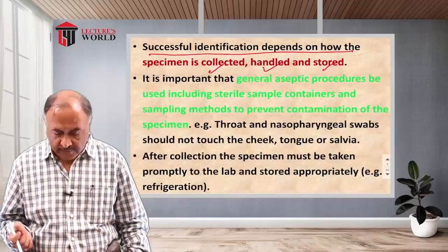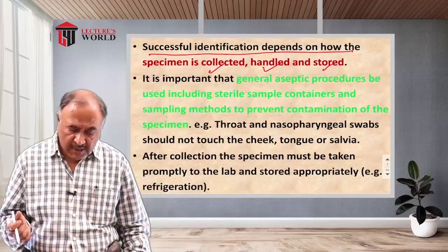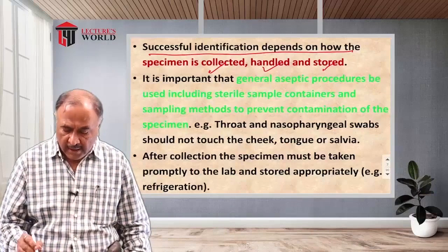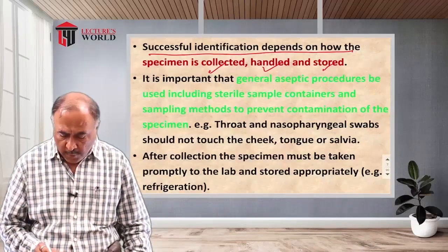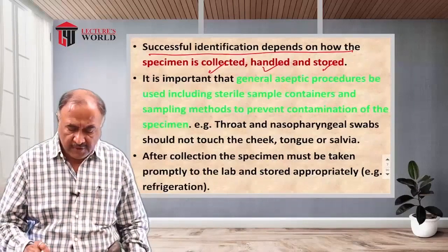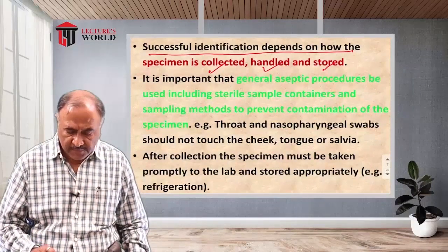After the collection, the specimen has to be promptly taken to the laboratory and stored appropriately, mostly in refrigeration, that is, at a low temperature.